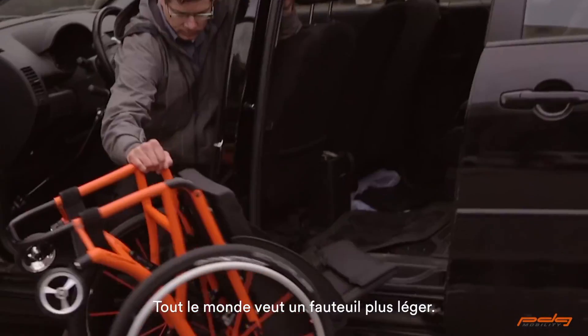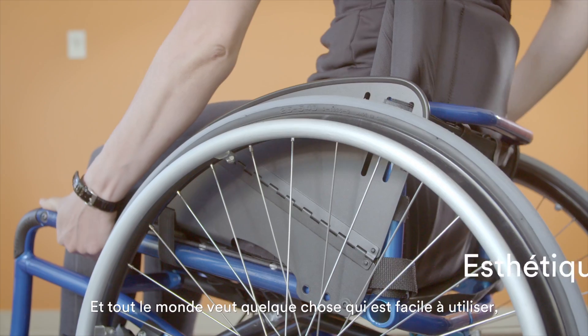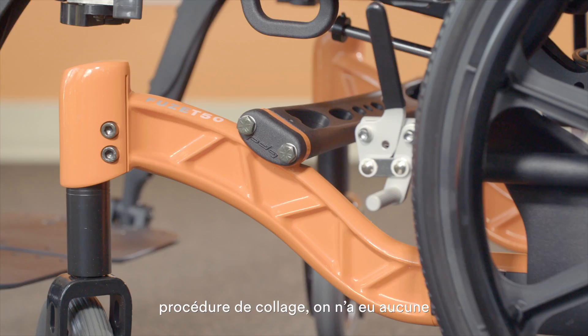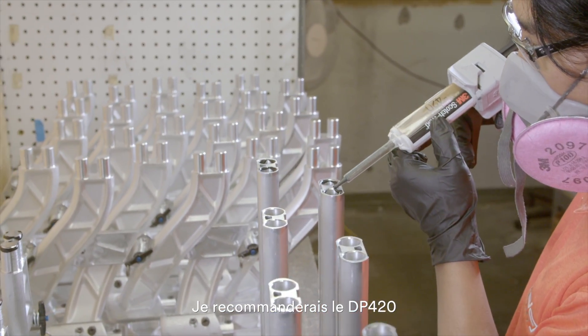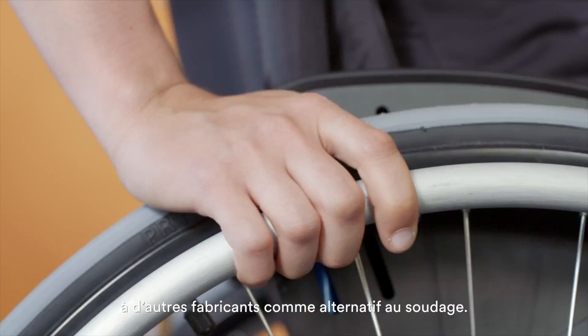Everyone wants a lighter wheelchair, and everyone wants something that's easy to use as well as looks nice. We haven't had any fatigue failures or any frame failures since we've implemented the bonding procedure. I would recommend DP420 to other manufacturers if they're looking for an alternative to welding.